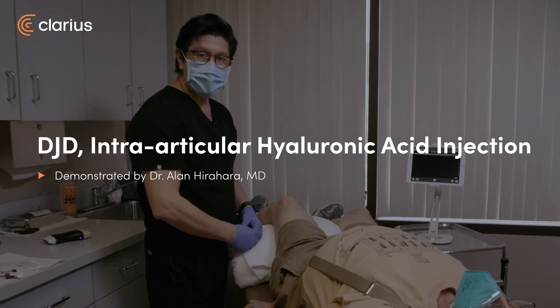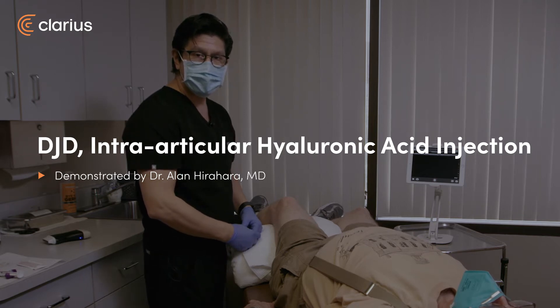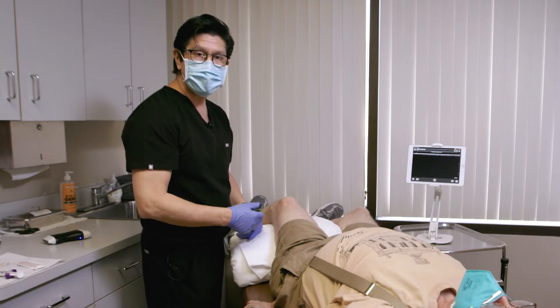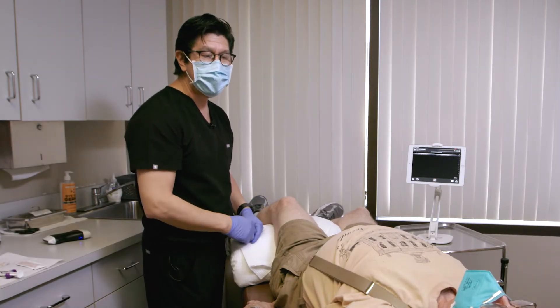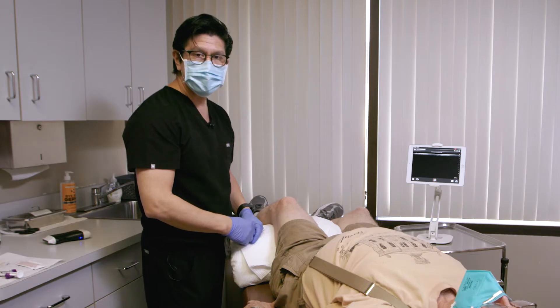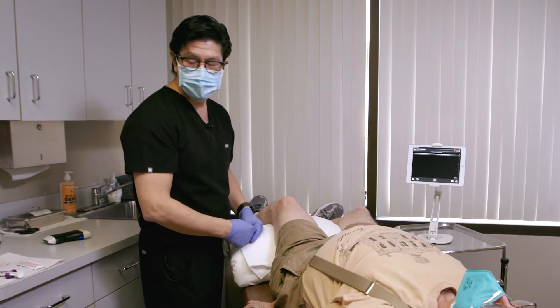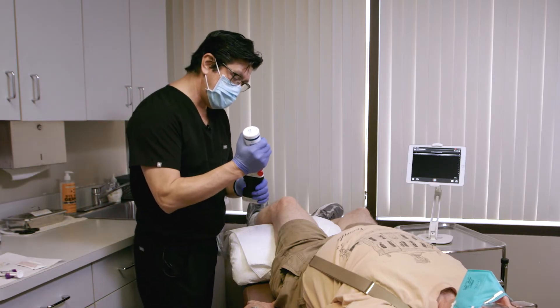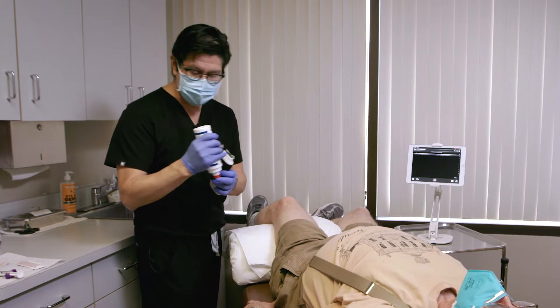Hi, I'm Alan Hirahara. We're going to be doing an injection using an ultrasound. We'll do an injection of hyaluronic acid into this left knee for a male who has degenerative joint disease and is trying to get some relief from this lubricant. We'll be doing this under ultrasound guidance using this Clarius device, L15.